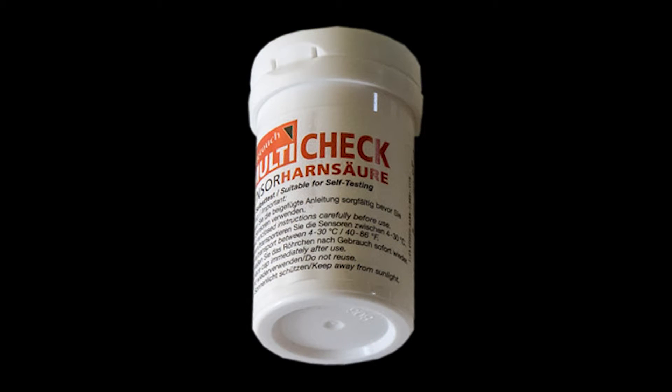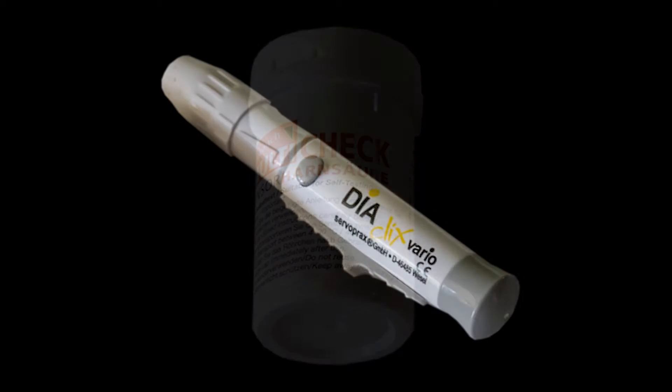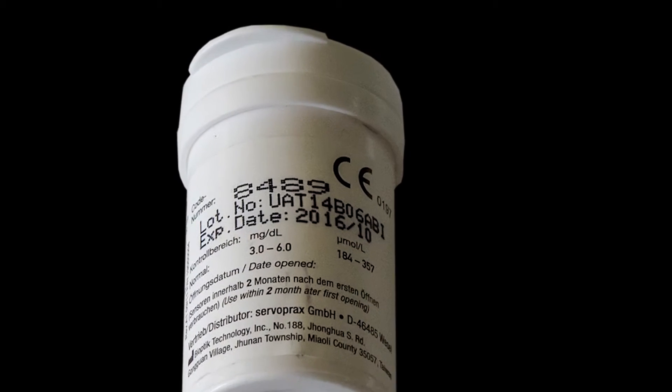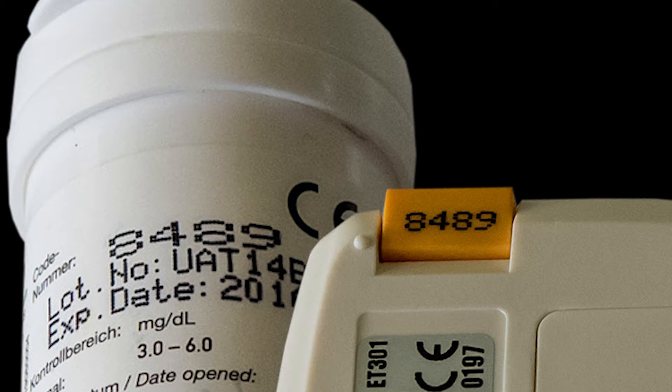These are also important indicators to measure the progress of your healing, so the extra cost is a good investment. The kit has measuring strips with a corresponding chip, a measurement unit, and a lancet for puncturing the skin. First, check that the number on the strip container matches with the chip in the measuring unit.